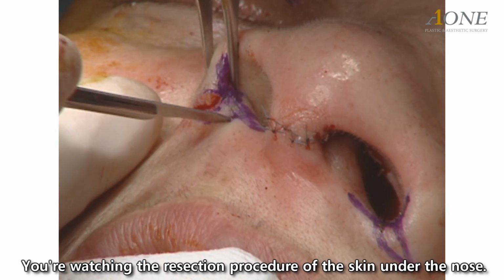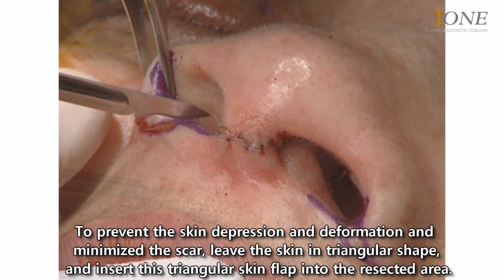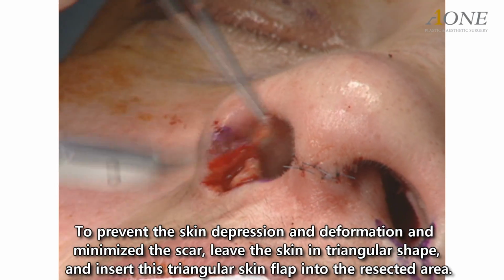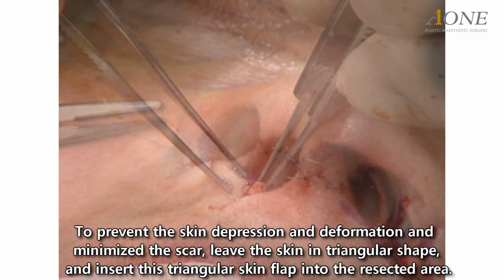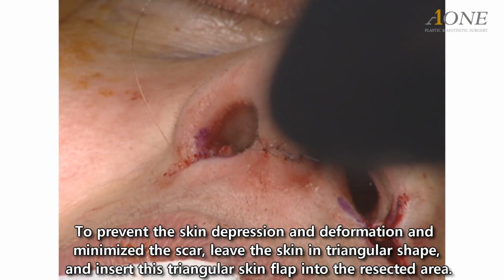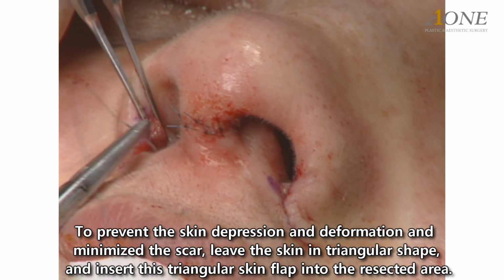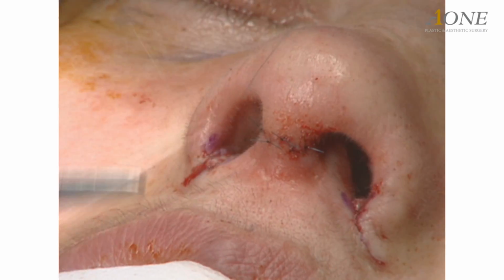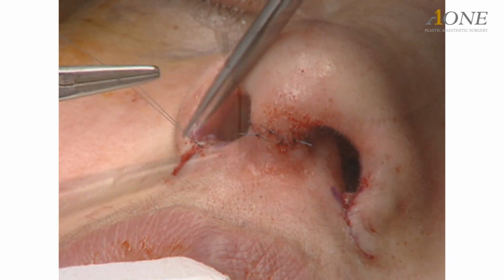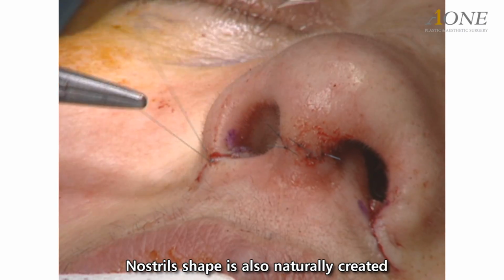You're watching the resection procedure of the skin under the nose. To prevent skin depression and deformation and minimize the scar, leave the skin in a triangular shape and insert this triangular skin flap into the resected area. The nostril shape is also naturally created.